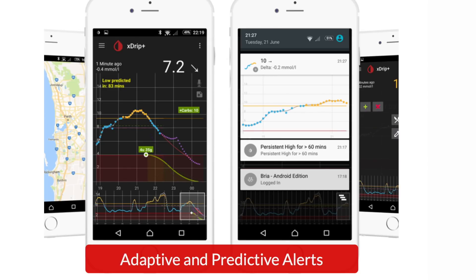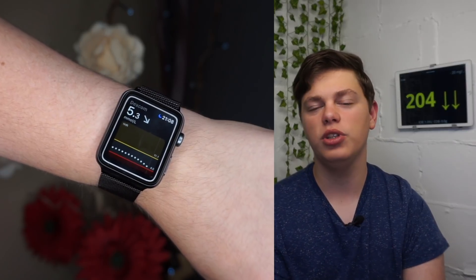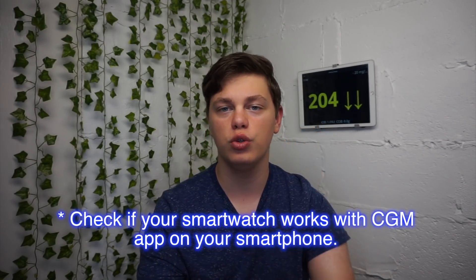All of those apps provide low and high alarms, and setup is very easy. Because your readings are now sent over Bluetooth to your phone, you can also display them on your smartwatch, just like your Dexcom. These community apps work with loads of smartwatches, from the Apple Watch to Pebble and everything in between.